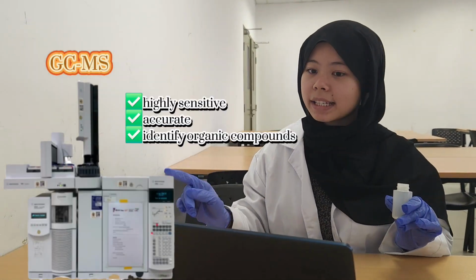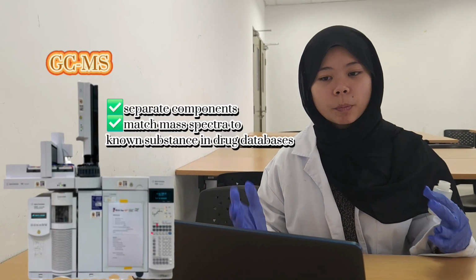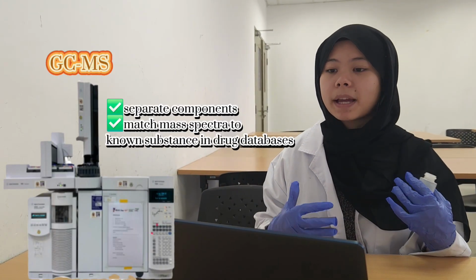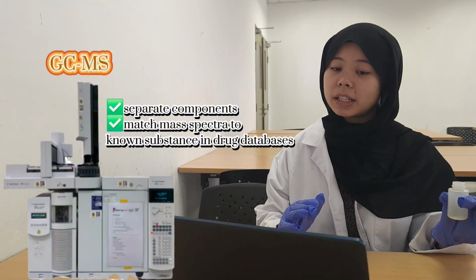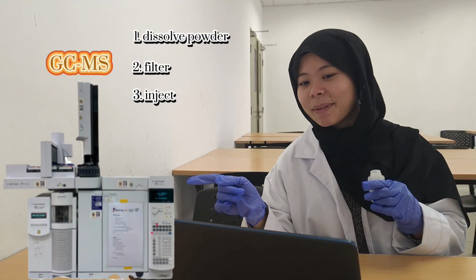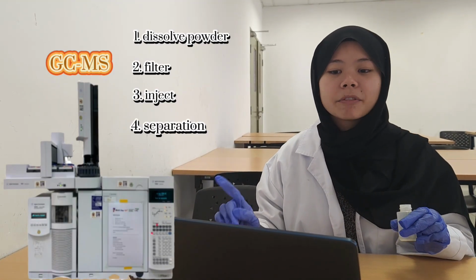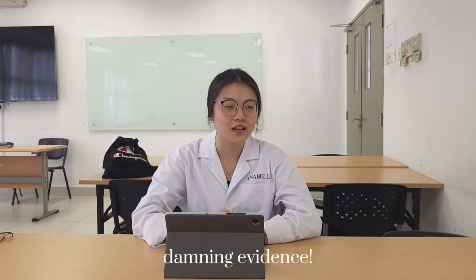So, GCMS is ideal because it's highly sensitive and accurate in identifying organic compounds. It can separate the components of a mixture and match their mass spectra to known substances in a drug database. First, I dissolve a small amount of powder in a solvent, filter it and inject it into the GCMS. The gas chromatography separates the compounds and the mass spectrometer provides a fingerprint of each one. The powder contains cocaine hydrochloride, confirming the presence of an illegal drug.